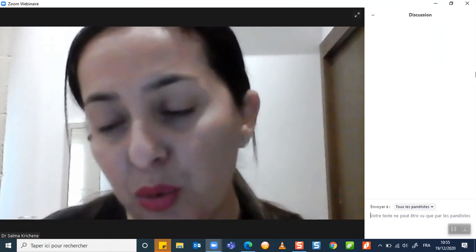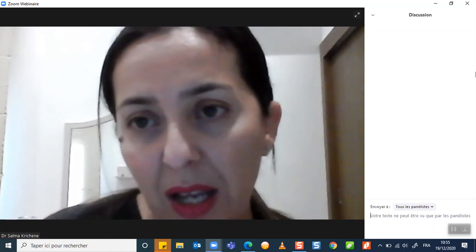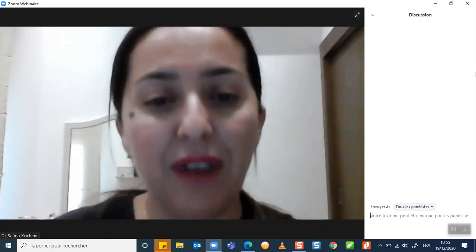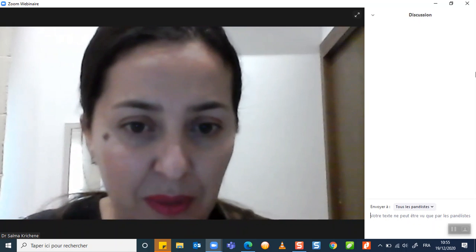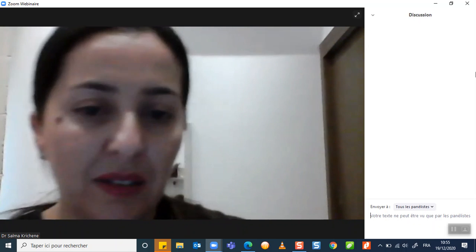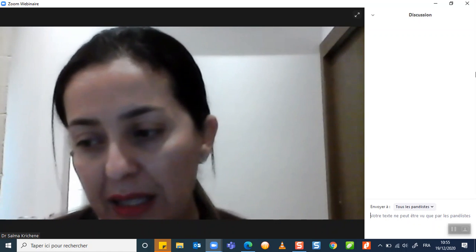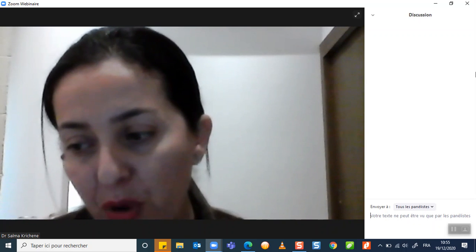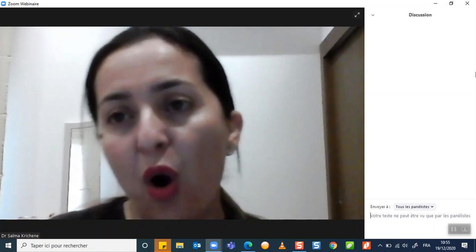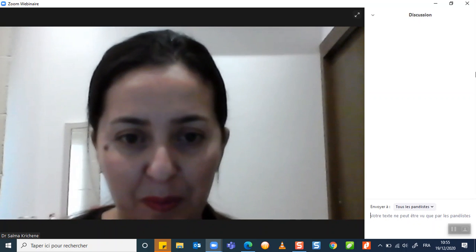If we open the VT zone, we must start from 185 beats per minute to 220, and VF up to 230. So I agree with you. This programming is recommended, but it's not the same for all manufacturers and all types of device. Thank you very much.